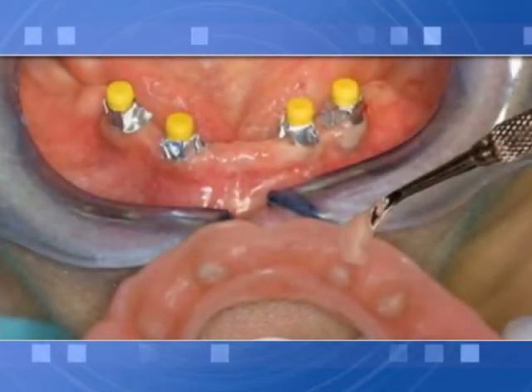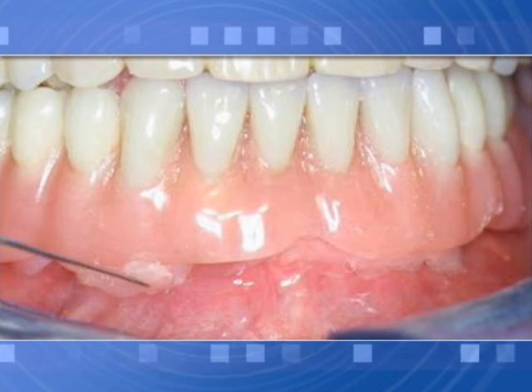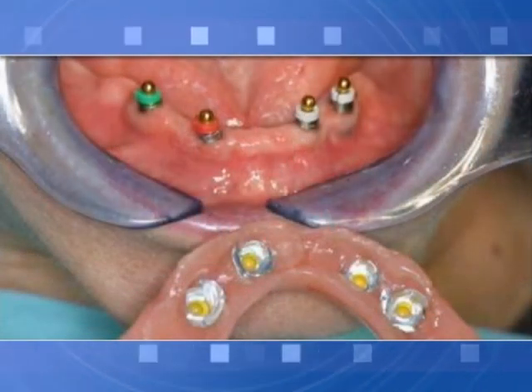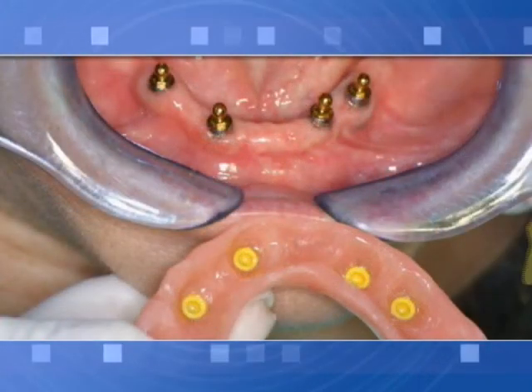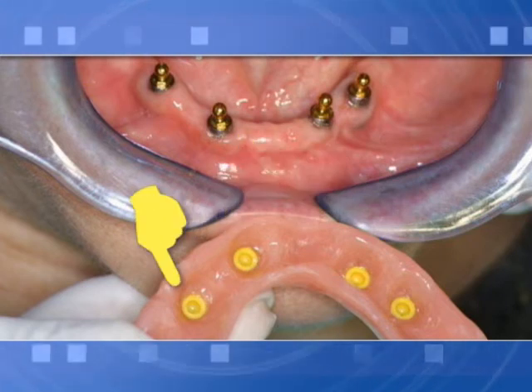Temporary denture: curing of retentive caps in the patient's mouth. During cap curing with resin, always use a protective disc to avoid risk of blockage by resin waste — a piece of plastic or a disposable glove can also work well. Polish the denture to remove resin waste and deliver to the patient. Be sure no resin waste blocks attachment surfaces.